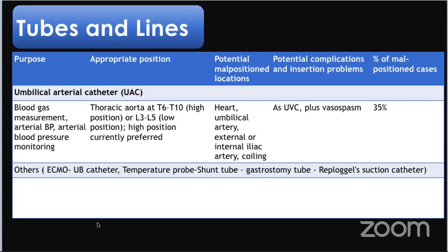Other tubes: the ECMO, the umbilical catheter, the temperature probe, and also the Replogle tube.